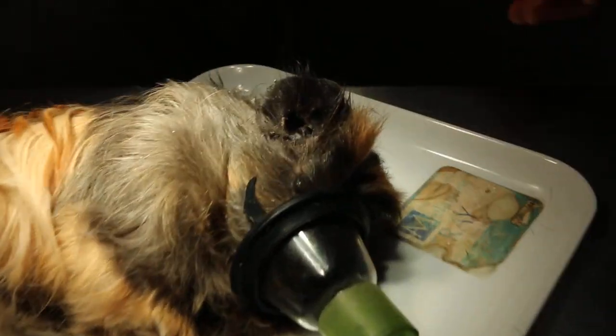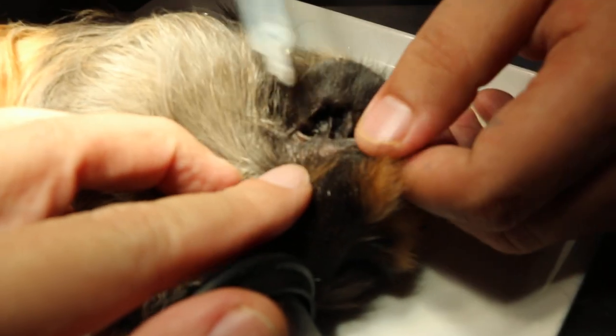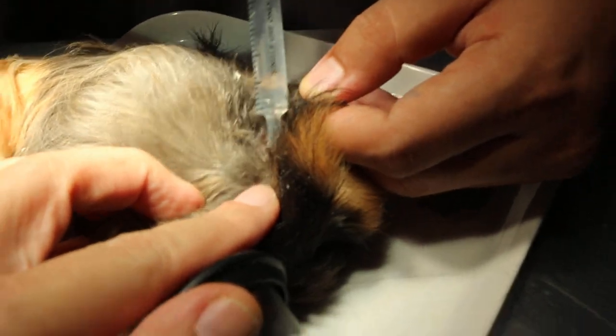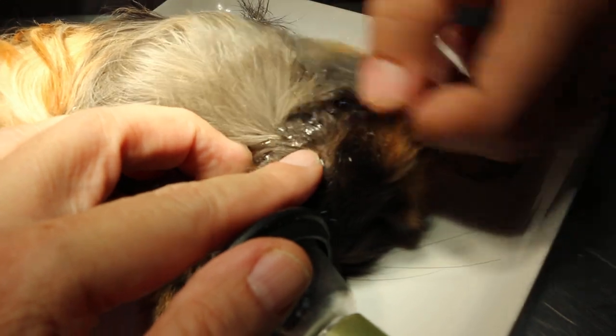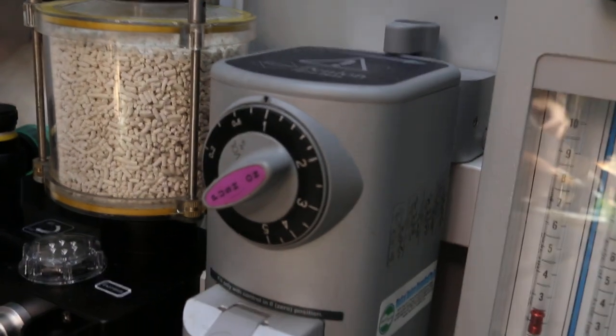We're getting clippers here to shave more hair. Then we do the ear irrigation. We're giving it some gas — 1.5%, 1% isoflurane gas.